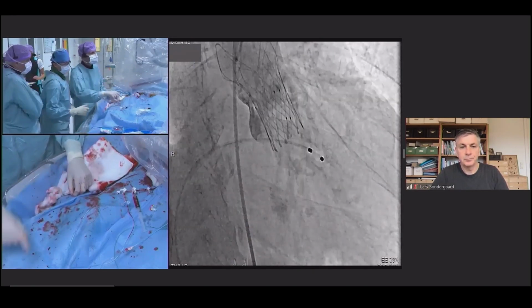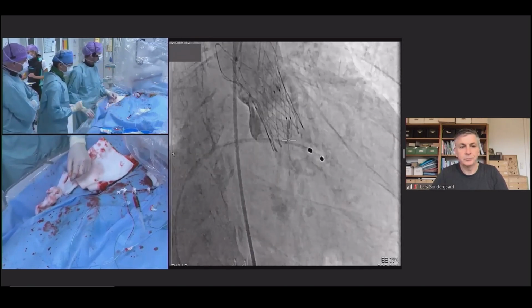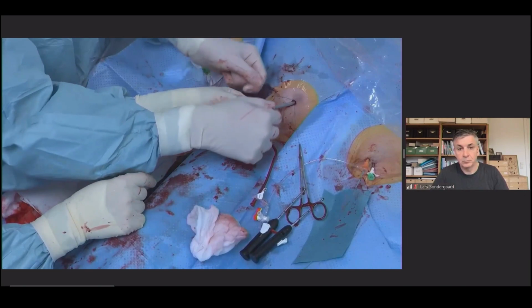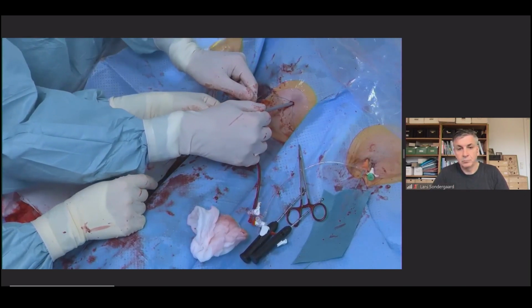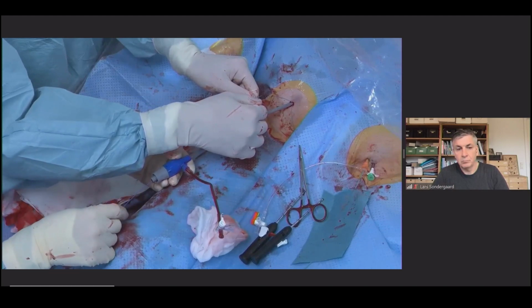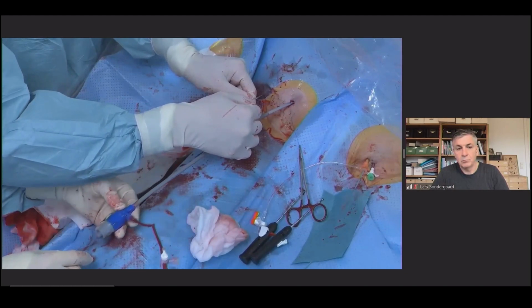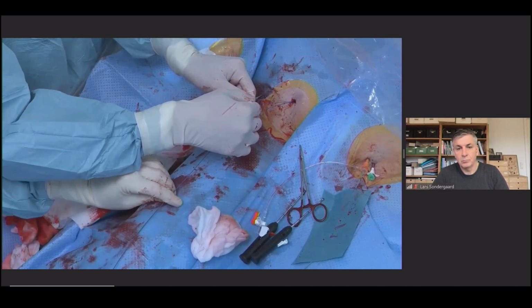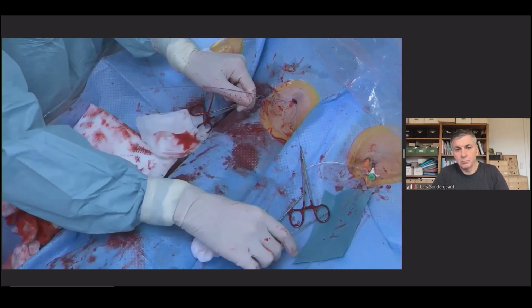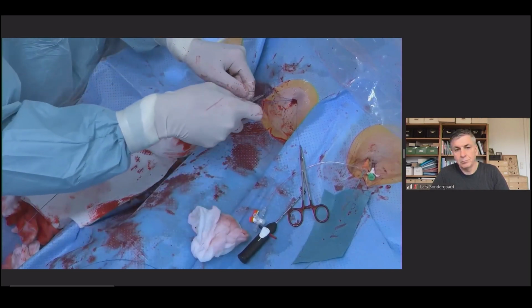So let's show how to close the access vessels. Will you just tell us what we're doing? You have those two sutures, yes, the two with sutures I have now. I'm going to just pull on it. So we keep the wire in. Then somebody can also give me the pushers. Oh, they're there. So just release one, take a pusher. It's going to be fine. As long as you pull, there's no bleeding.